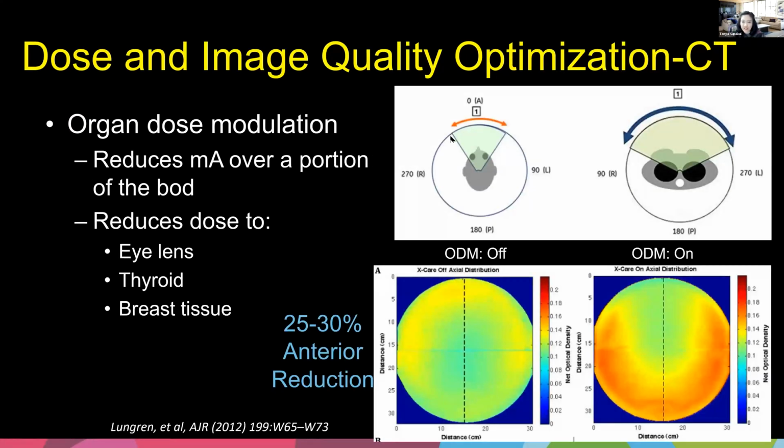I mean, you just push one button and it works. Yep, that's it. It's one button. It really quite literally is that simple. But what is the rationale behind that? Things like the deep learning stuff, that they know this is the organ that needs to reduce the dose? It's getting there, but not currently.